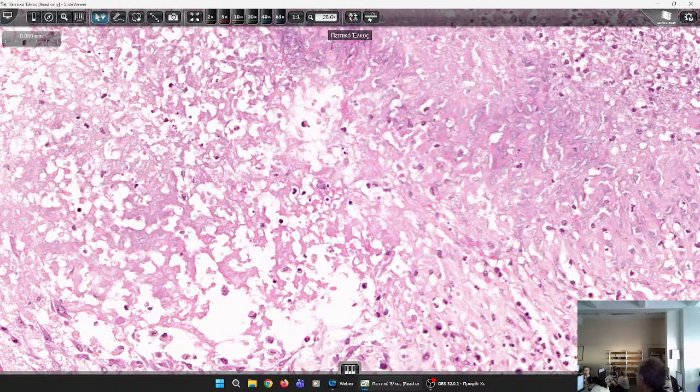Yes, please. Do you also see fibrinoid necrosis in malignant hypertension? I think, yeah. You see that in the vessels. Yes, correct. Yes, this is another case when you see that type of necrosis. Because when you have malignant hypertension, that means that the pressure is 300, the big one, and 150, the other one, the diastolic one, and you see damage in the vessels of the retina.